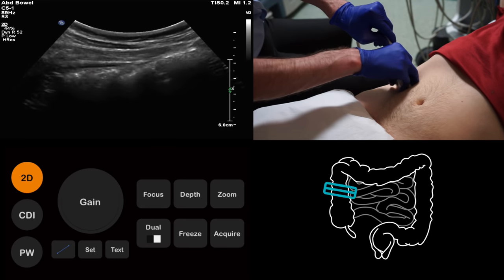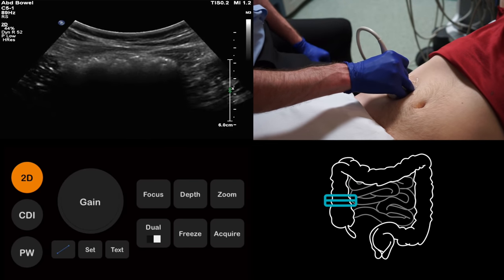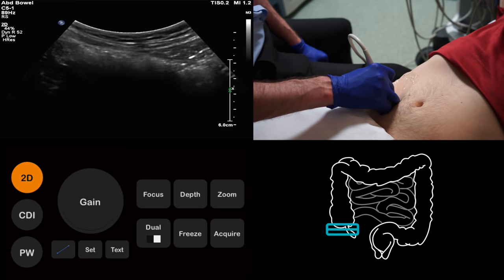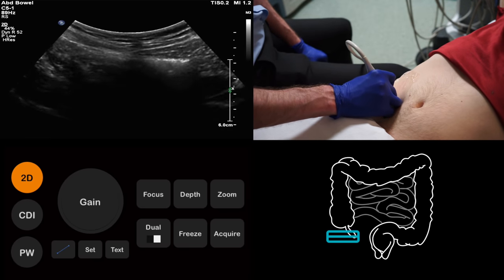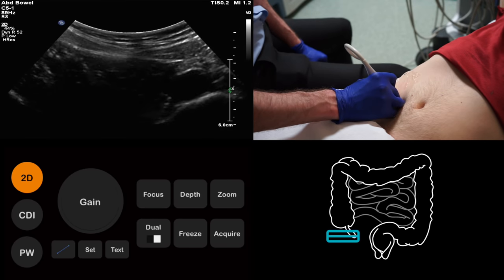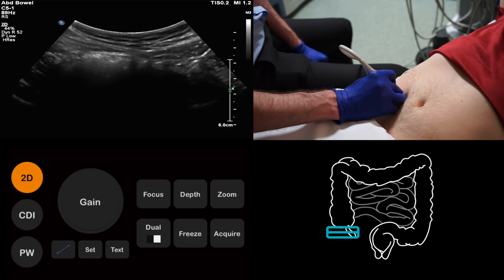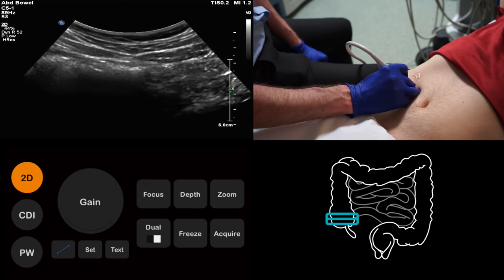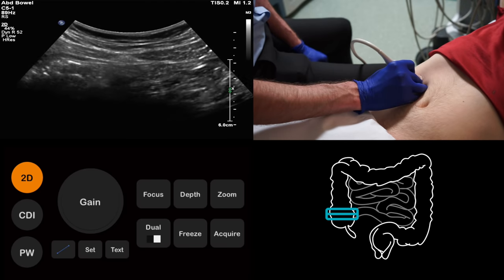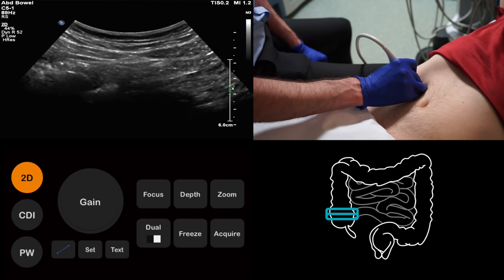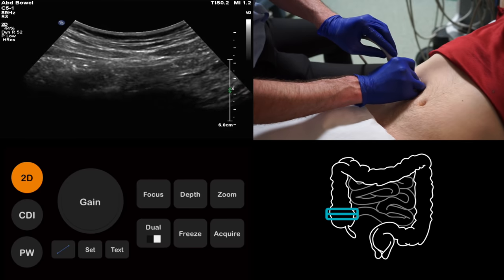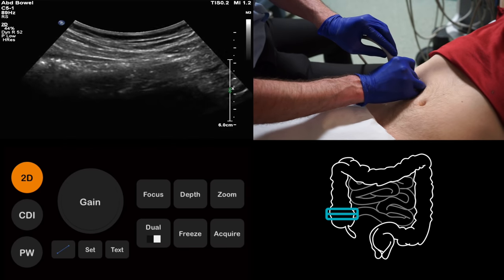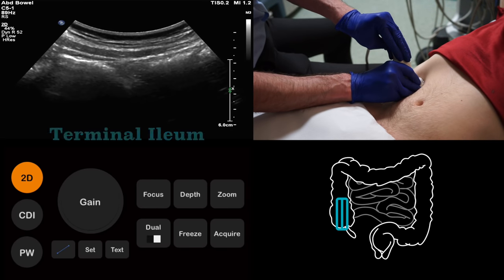Now we scan caudally. We pass from the ascending colon into the cecum, and then continue inferiorly until we have come off the inferior end of the cecum. At this point, we scan back up again. We are now looking for the terminal ileum. Finding the terminal ileum is important, because pathology here can mimic appendiceal pathology. We first identify the terminal ileum in its long axis, and then we turn the probe 90 degrees to image it in its axial plane.